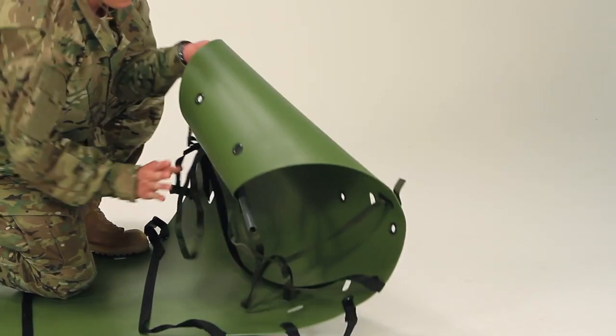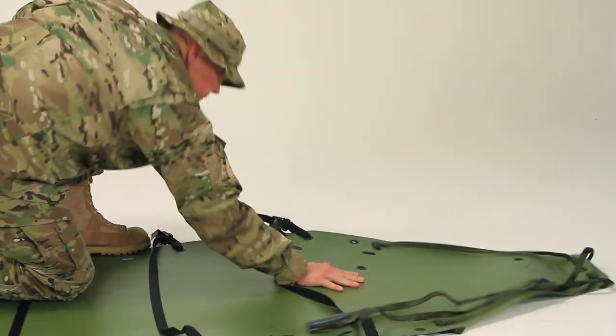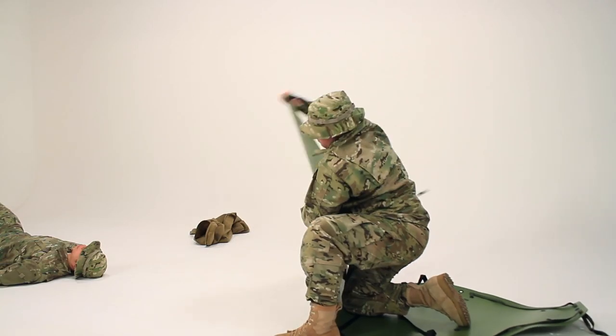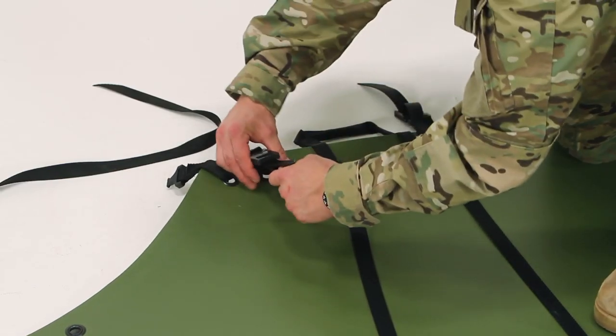Hug the Sked with your other arm, holding it against your body. Fold the top over your arm, then reverse roll the Sked to take out the curve. Do the same on the other end. Unfasten the cross straps and lay them off to the side.